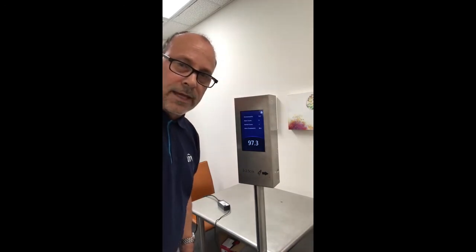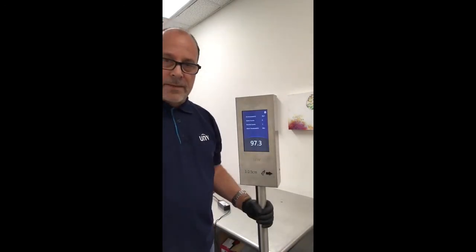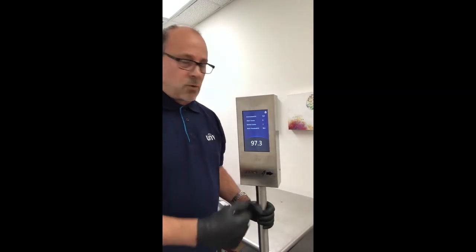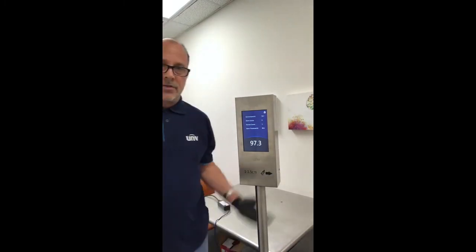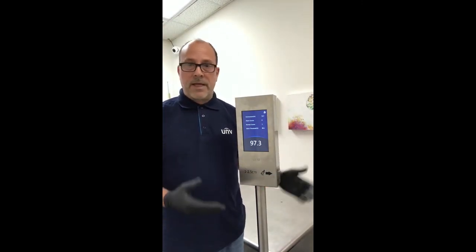Looks like I'm okay, so I'm going to proceed. If a temperature is abnormal, an alarm will trigger. It'll display what the temperature is for the abnormal reading and cause an alarm trigger, which will alert people that you have an abnormal temperature. But that's really it — it's super easy to deploy, very easy to use, very portable, and you can have the system up and running in no time, screening temperatures.